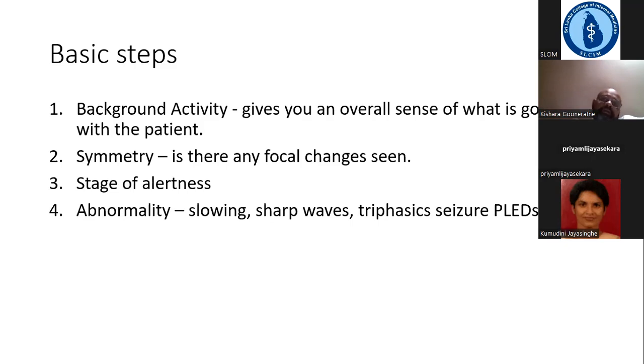at different frequencies, starting from a low frequency. There are different paradigms, but we generally start off with about 3 Hertz and then increase the photic stimulating frequency to around 30 Hertz. So those are called activation procedures. I'm not going to talk about what can happen during these activation procedures, because that is beyond the scope of this talk. However, just for your information, these are the things that we would generally do during a routine EEG and acquisition of the EEG data.